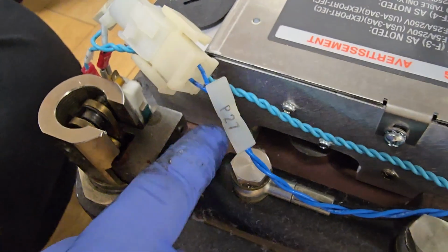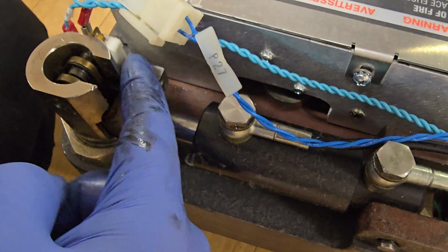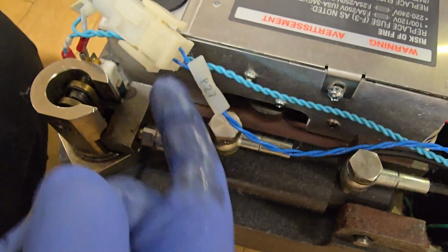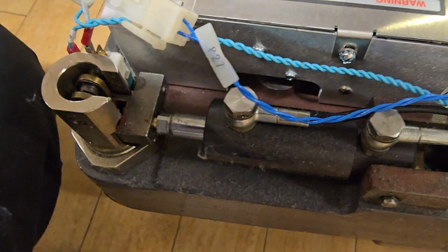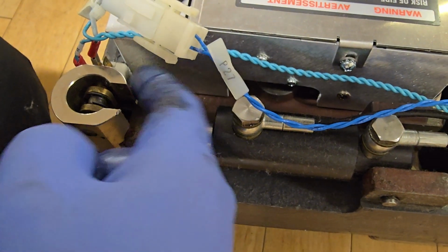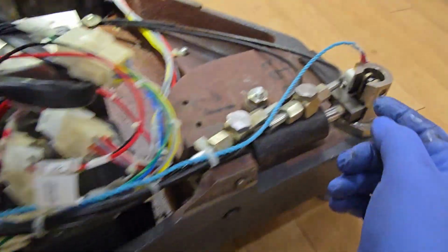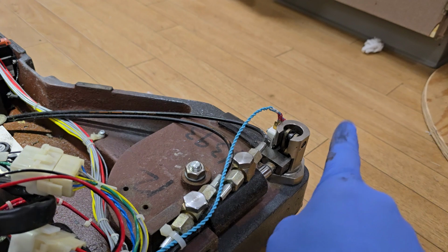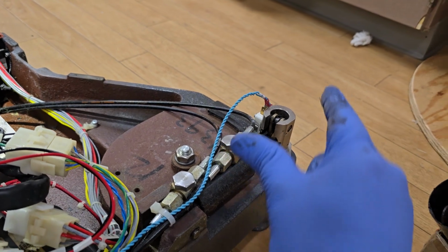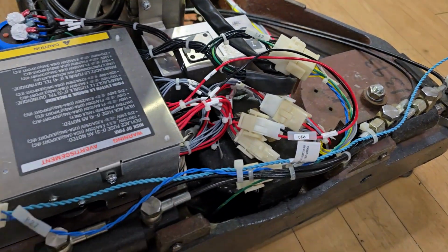And anytime you see a cracked switch, always check this guy right here. The set screw was in way too far. It was depressing on the plastic of the micro switch itself. It should be just enough to activate that switch. I got moly grease all over me. And same thing on that side. Make sure that it's adjusted so that it's just activated on the switch, and a little bit extra. Make sure that set screw isn't smashing the switch. That happens too often.